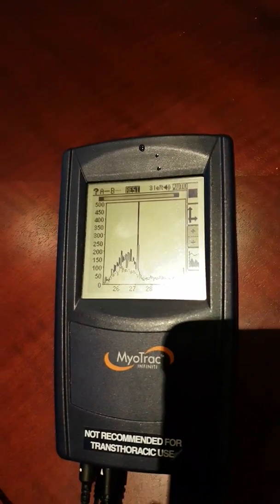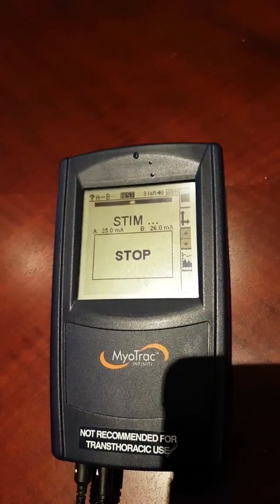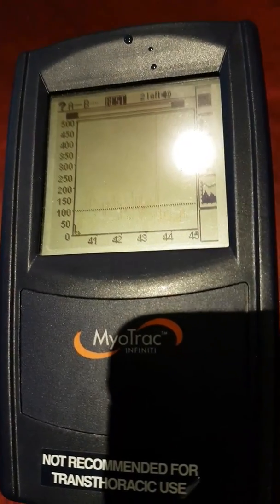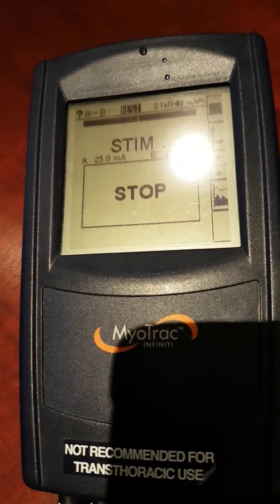Work. And you notice on the top here we have a counter for how many repetitions we have left. And then we have that black bar filling in, that's our timer. Work. Rest. Work.